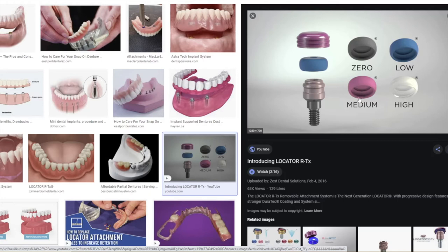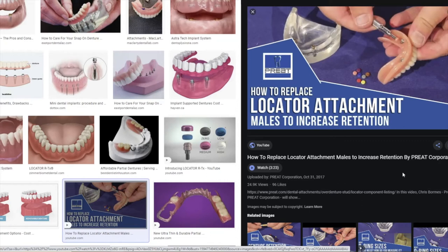So you could just always tell your dentist. How easy is it to take on and off? Well, honestly, you see a little image right there. It's just like you go in to see your dentist, he just pops it out, and then he could pop a new one in there real quick. So it's a pretty quick and easy appointment.